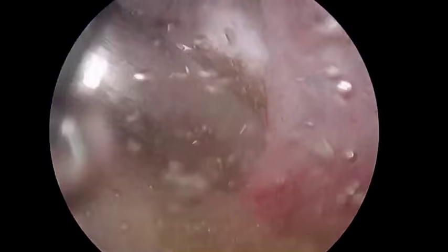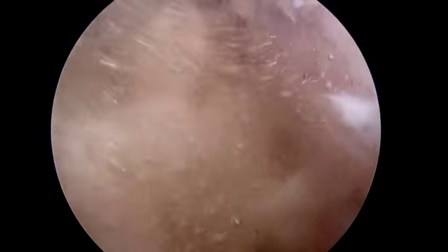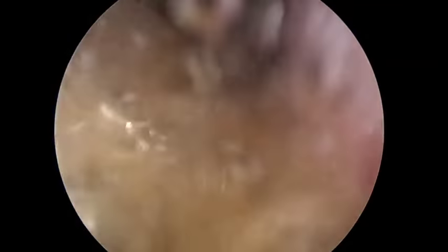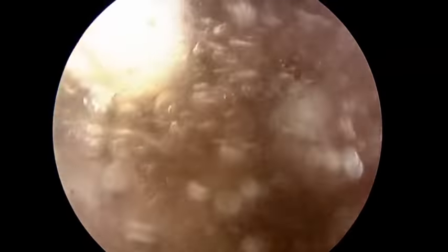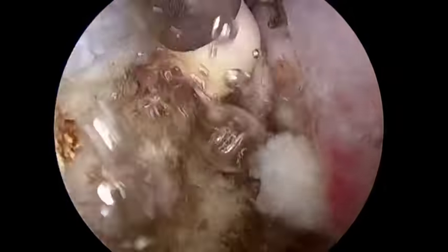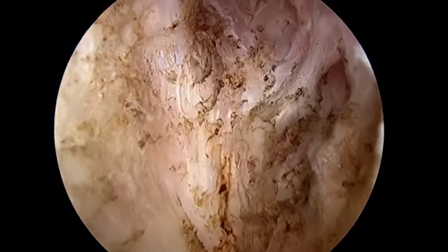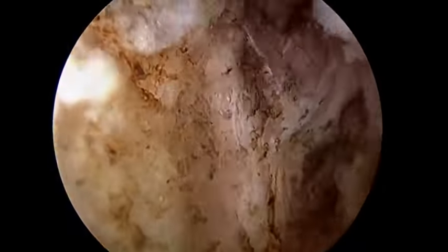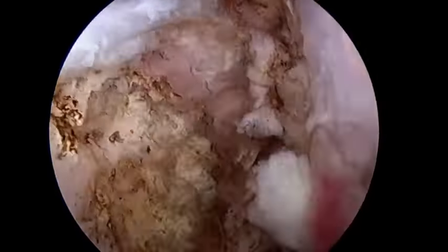Taking down just more of the scar tissue. Shave it one more time. I'm going to identify the acromioclavicular joint in a moment, as soon as we get some of the stuff out of our way so we can see what we're doing. So if you watch here as I push, that object that's moving there is the undersurface of the acromioclavicular joint there.